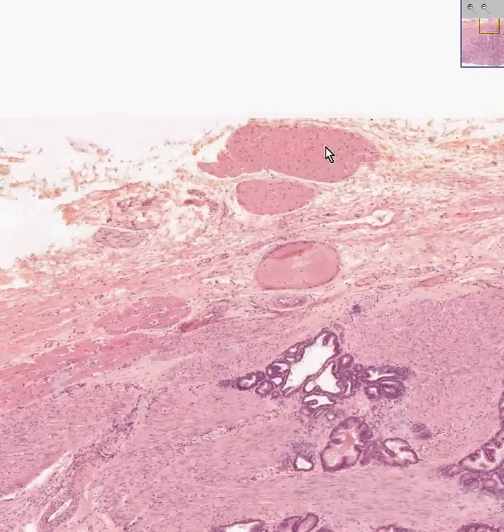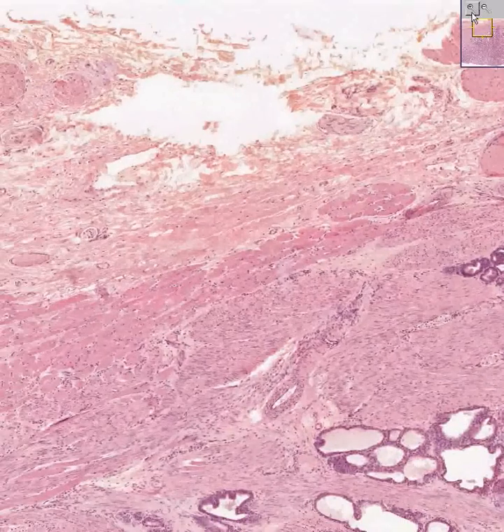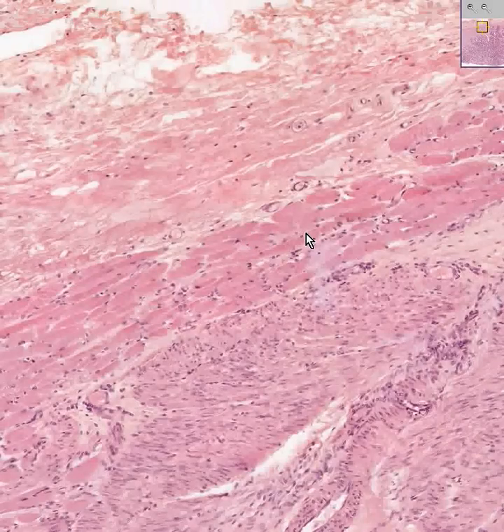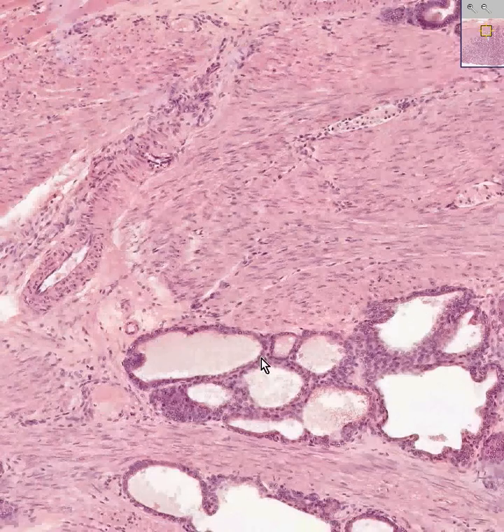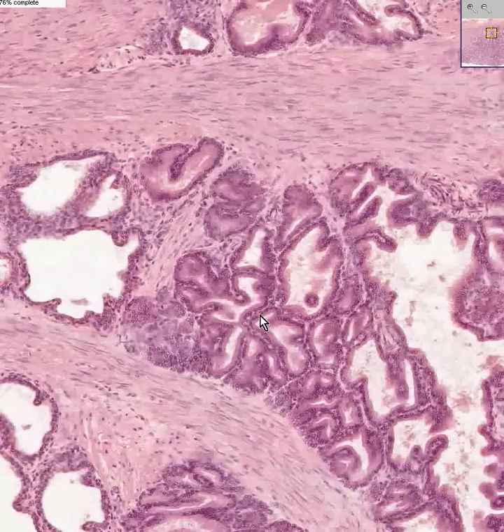That looks like there's a little bit of smooth muscle there. That looks like a vein. This could very easily be some skeletal muscle fibers — and sure enough, here are some skeletal muscle fibers. Here are some smooth muscle fibers. Here's the smooth muscle of a blood vessel, with a couple of endothelial cells. Here are some prostate glands which don't look too juicy, and here are some nice prostate glands which look very juicy.